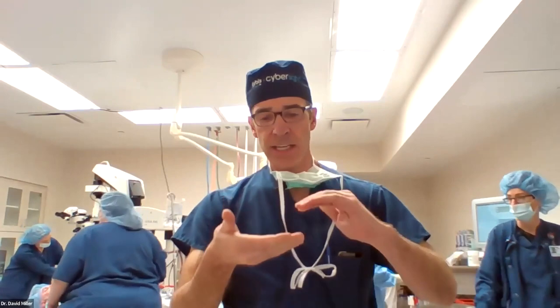What parameters do you use while peeling the ILM with the cutter? You know, it's actually the same parameters I have it set for the vitrectomy. So in this case, it's aspirating at 350. So it's not any higher than a standard vitrectomy for me. And I do have the pedal floored, so I'm getting all 350. Then it's just a matter of how deep you go into the retina with that tip. So you have to make a little indentation in the retina.